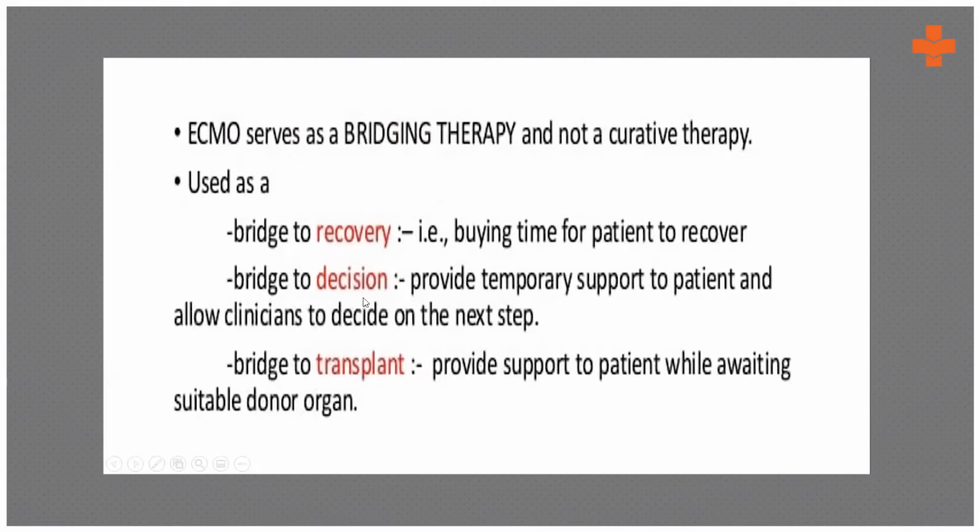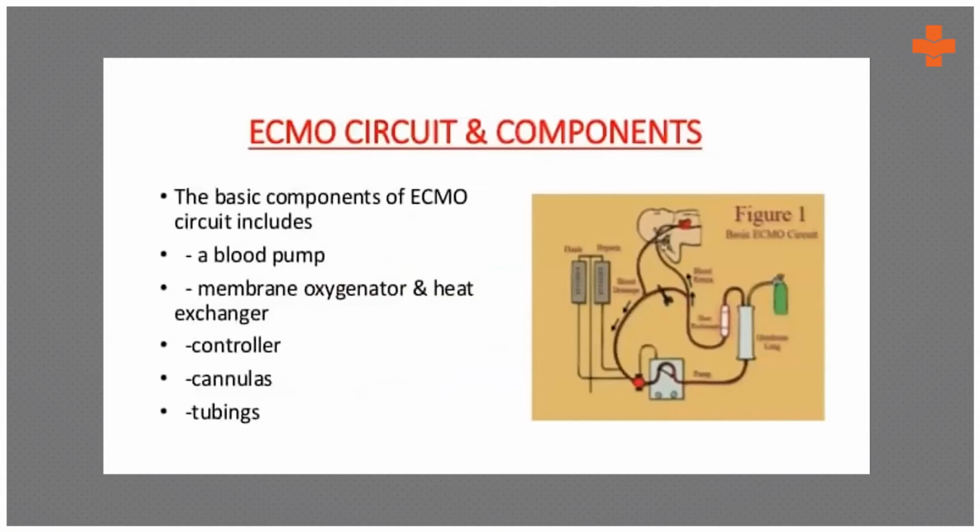It is a bridge to decision, that before you decide what is the next step, you can put the patient temporarily on ECMO. Or it is a bridge to transplant, in case you know that the patient is not going to recover. You're waiting for a lung transplant or a heart transplant, so you can put the patient on ECMO while waiting for a suitable organ.